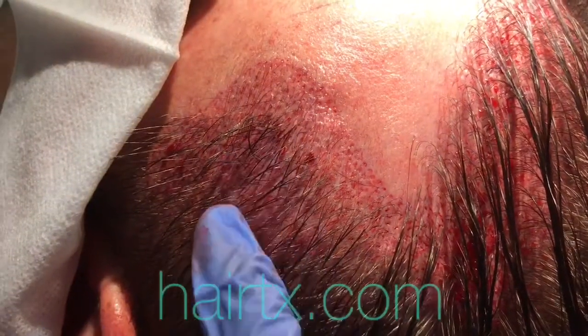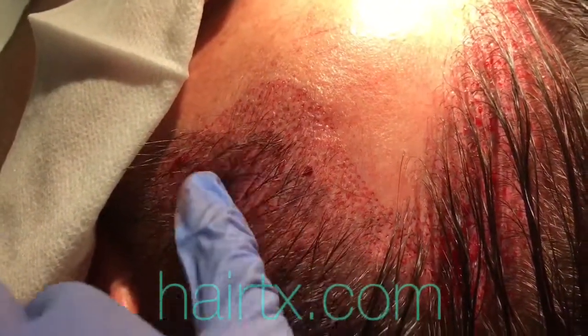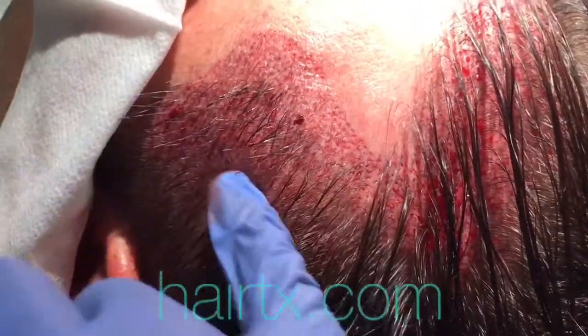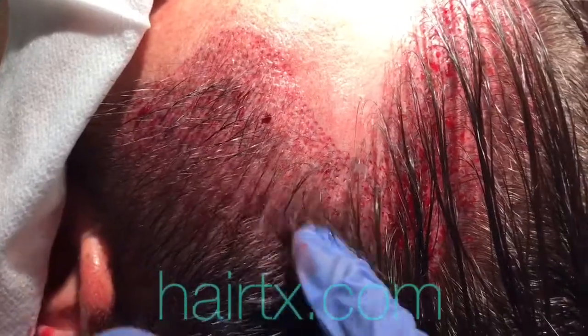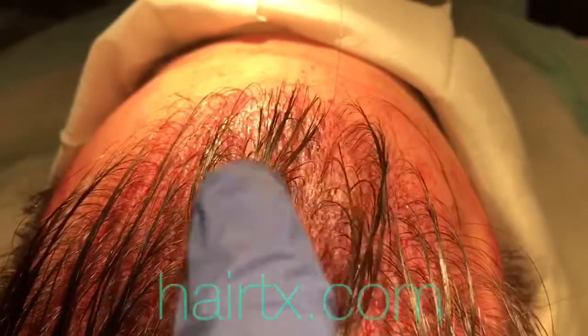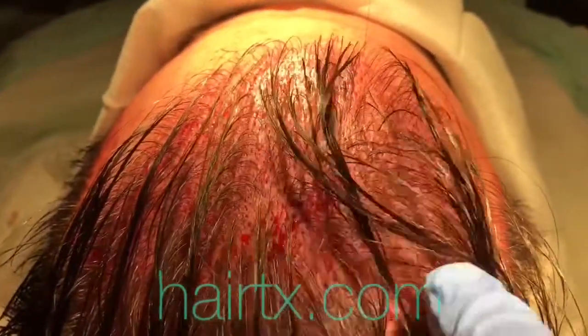And then these are those coarser hairs that were transplanted elsewhere. And what I've done here is really created a very tight configuration going down all the way back here. He's a younger gentleman, and you worry about further recession, so we've gone pretty far behind his natural hairline to accommodate for further recession. The biggest thing here is really overpowering these grafts so that he has more stylability, more density, and that is all the way across, even into the central forelock.